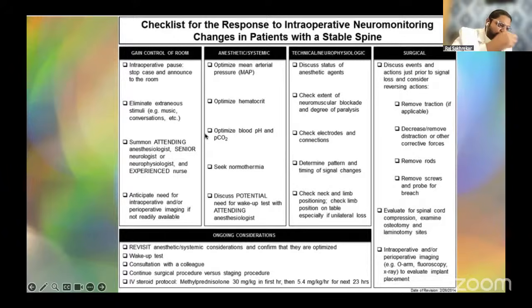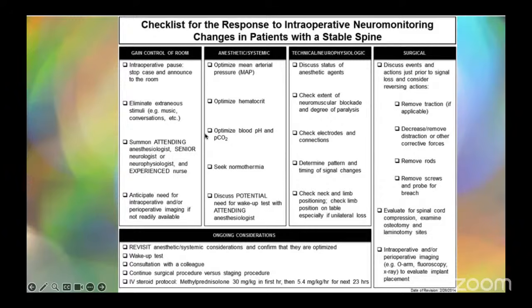Have you all seen that steroids and warm saline really help in your surgeries, when there is a drop and we raise an alarm, and we give a warm saline wash and steroids? Does it help? Have you all seen it in your cases?